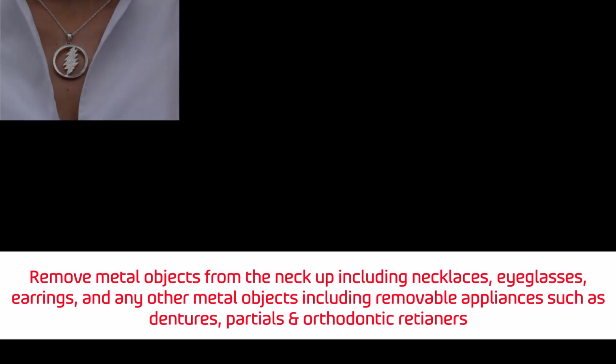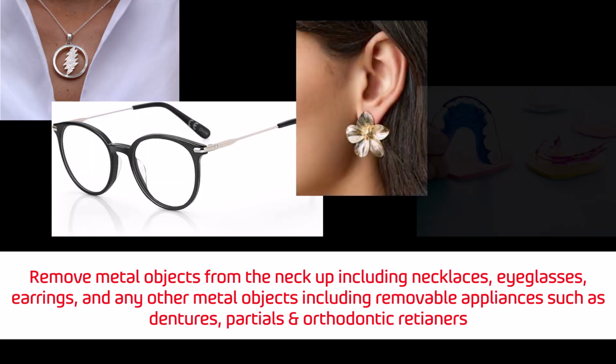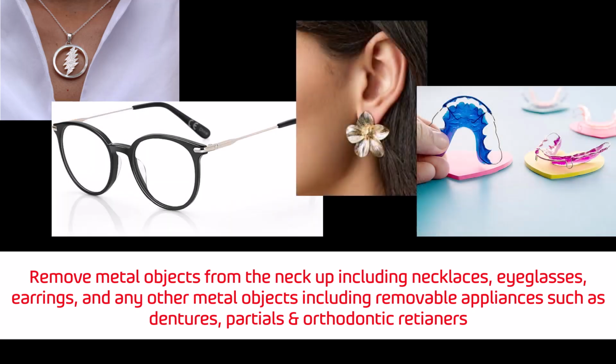In preparation, have the patient remove all metal objects from the neck up, including necklaces, eyeglasses, earrings, and any other metal objects.